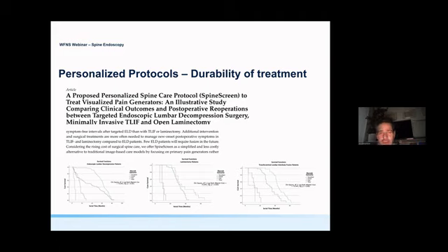If we now look at how patients profit from fusion procedures, from endoscopic procedures, and from traditional laminectomies, we see that they all perform pretty well. But if the indication is selected properly, the patients with the full endoscopic transforaminal decompression, for example, have the longest survival rate, which means that they do not need another surgery as often.